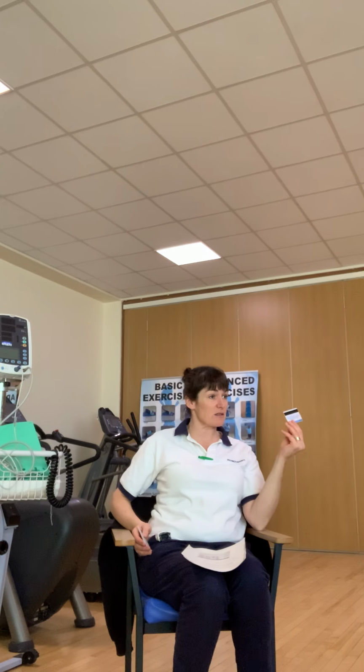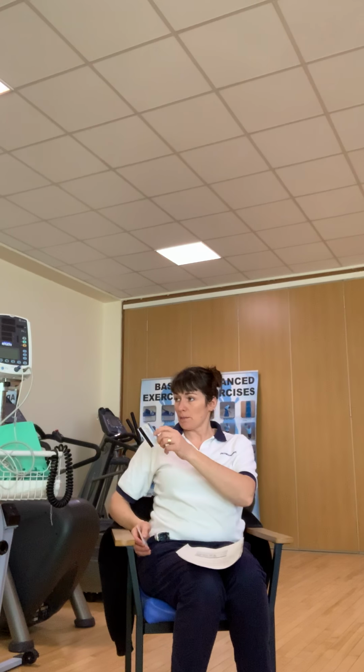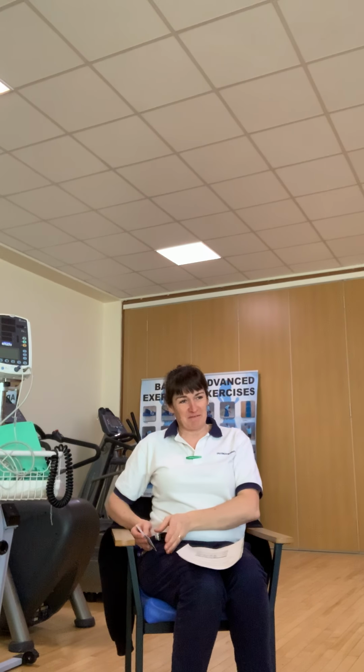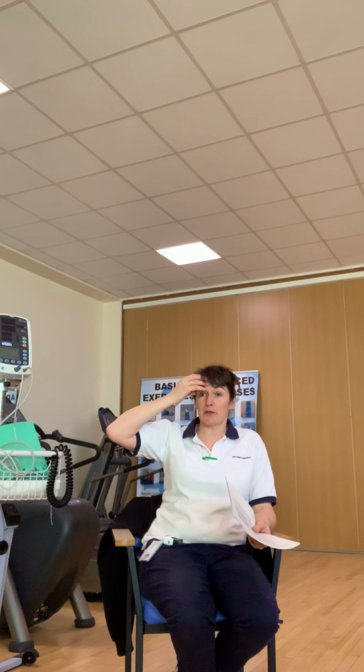Have you all got one of these single swipe cards? If not, we need to make a little list and we'll get it sorted. It'll be fine. It's the thing you use for the printer, isn't it? Yes, it is, yeah. And to check affinity and all the other cooler things like that. But yeah, if you zap onto that, then the main screen will come up, and then you click on the patient track 2 icon down there.